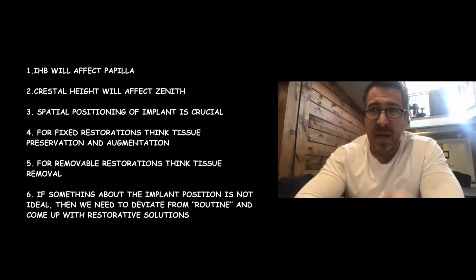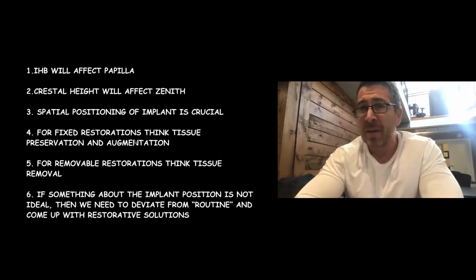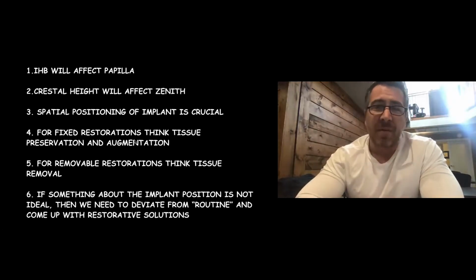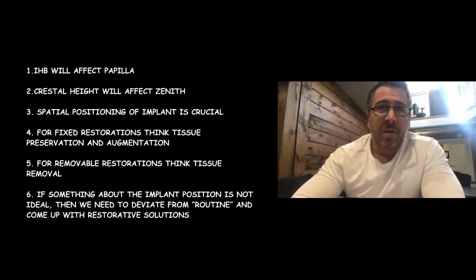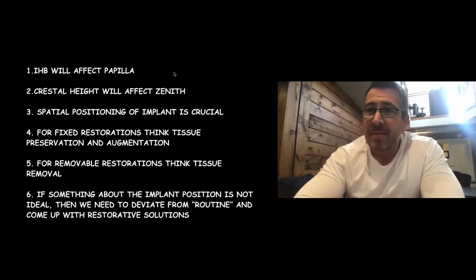And I know Kayvon mentioned his photography, and I think he probably does do that, because if he does pre-treatment photography of his cases, it'd be nice to have a photograph of those cases after they've been restored, so you can actually look at them and analyze them to say, hey, how come we ended up with this as being a great result, versus this one didn't, and what was the parameter that defined it. And I think if you look at those cases, you always come back to these things that I've highlighted here. So I think that's it.